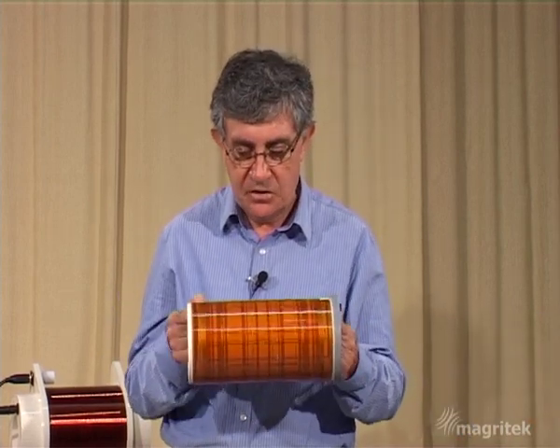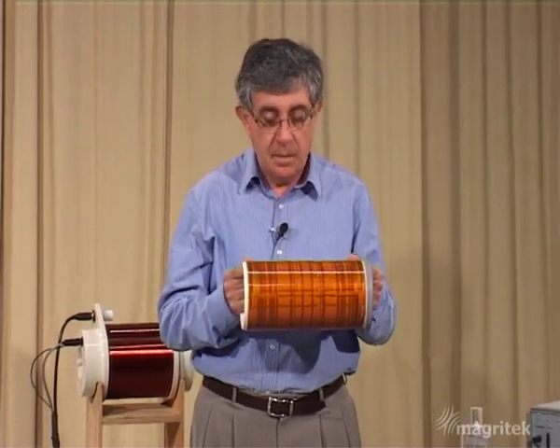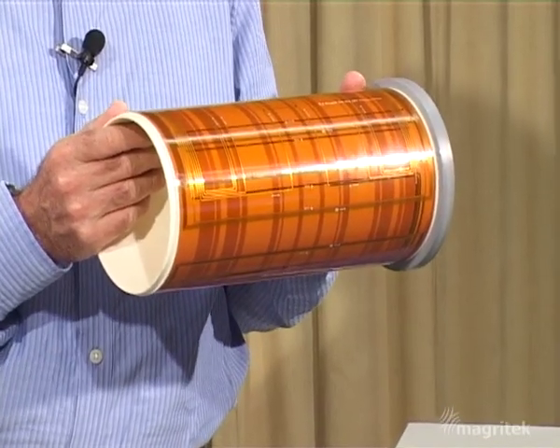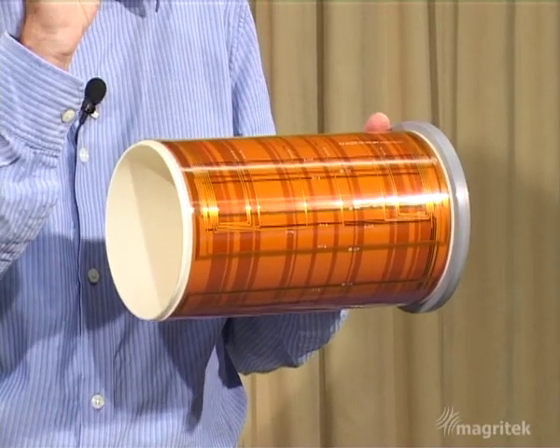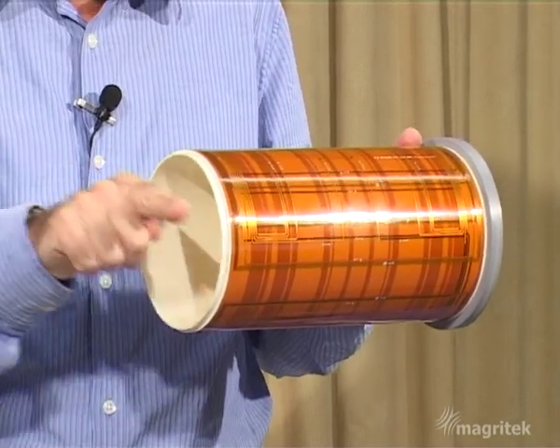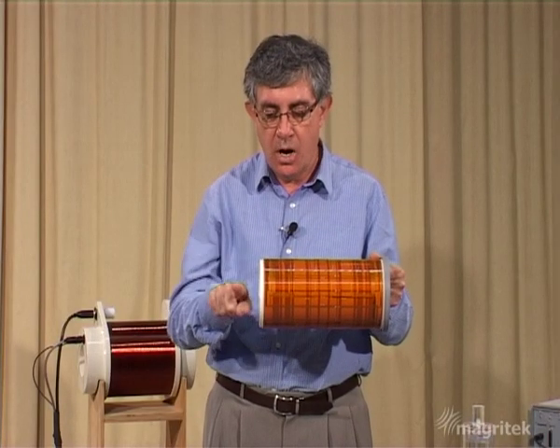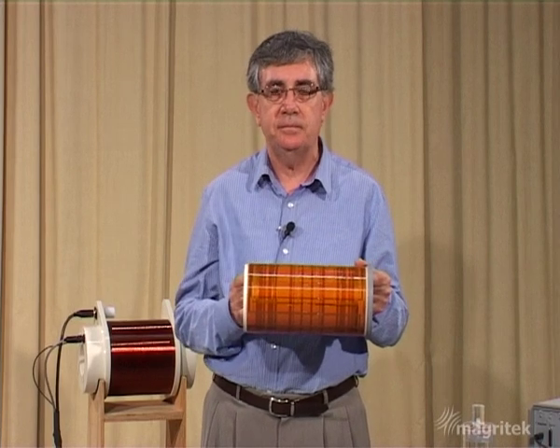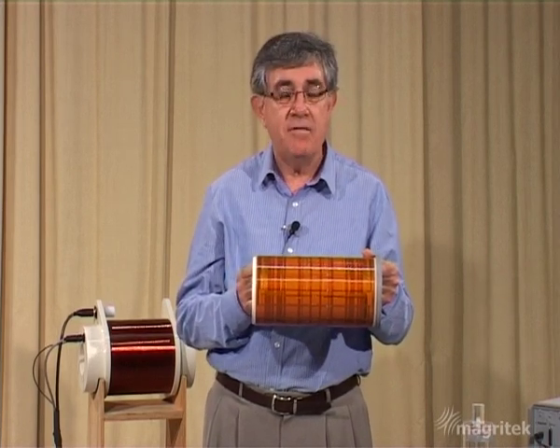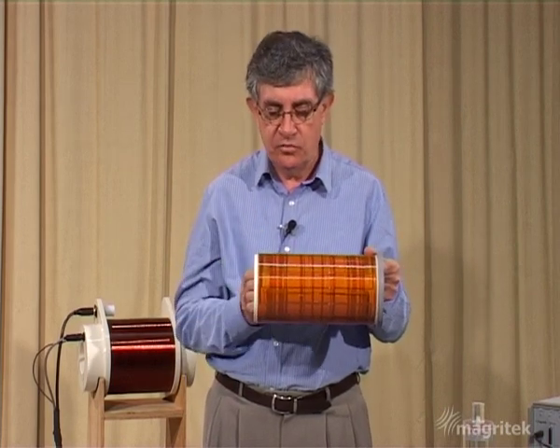How could we do that? Well we have the gradient coils. These are the coils that are inside the probe of the Terra Nova apparatus, and these coils are able to produce a variation of the magnetic field along the vertical direction, varying along each of three orthogonal directions: along the X, Y and Z direction. In this case of course we only need to have a variation of field along the Z axis where we're going to separate those two tubes of water.